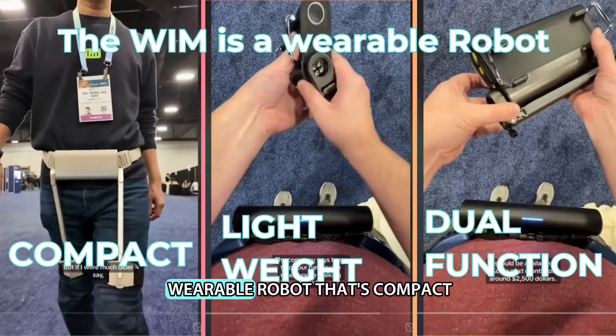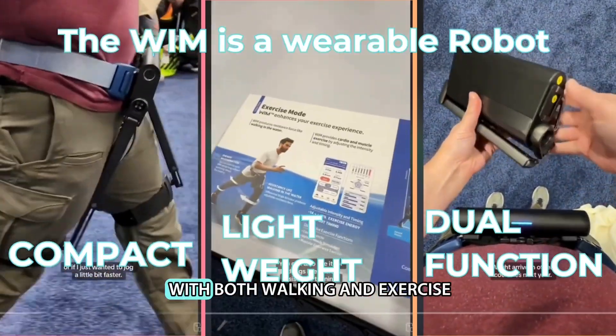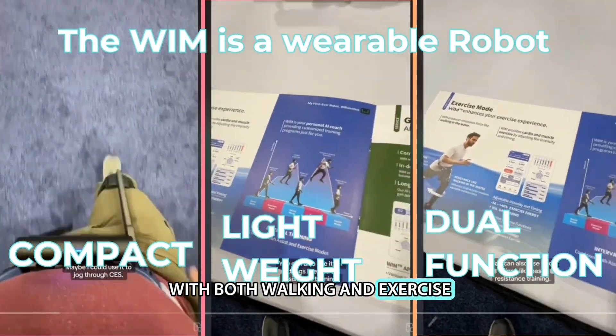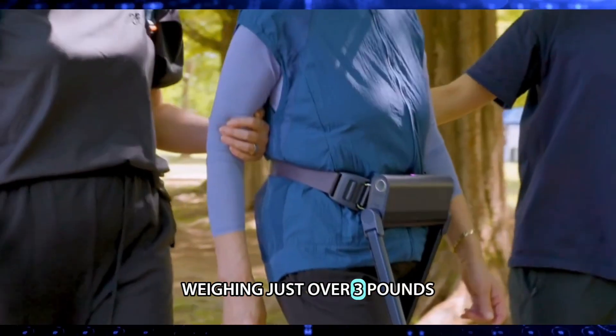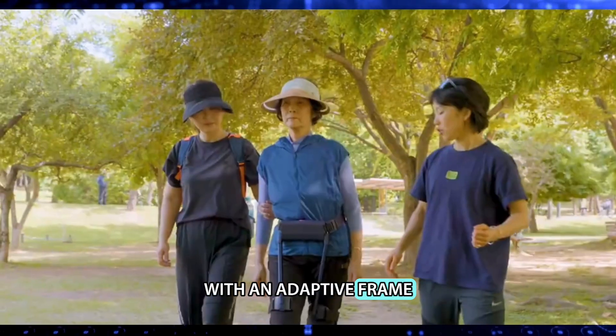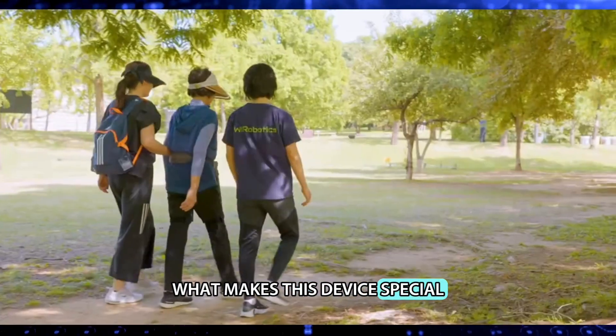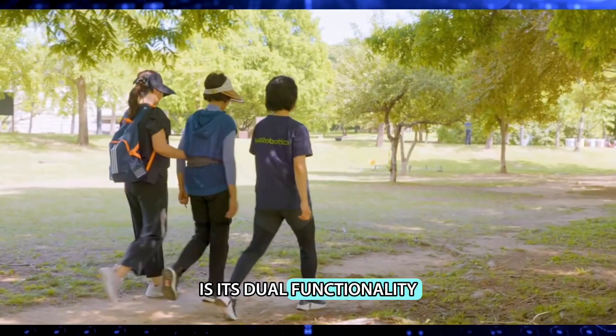The WIM is a wearable robot that's compact, lightweight, and designed to help with both walking and exercise. Weighing just over three pounds, WIM is easy to put on with an adaptive frame that fits all body types. What makes this device special is its dual functionality.